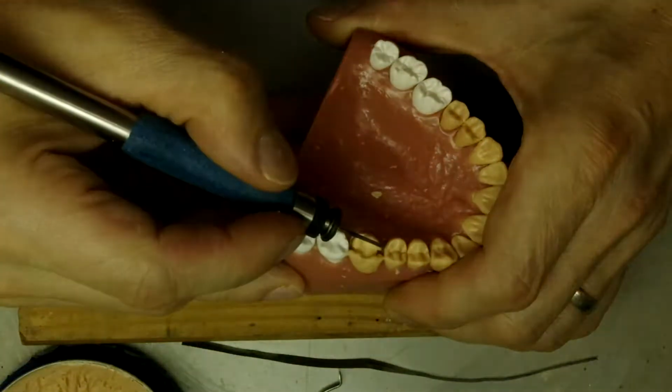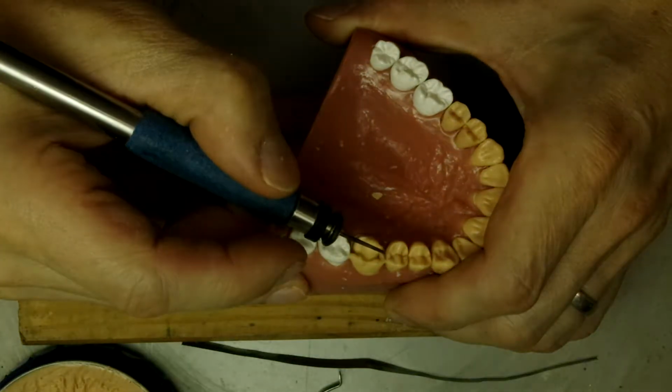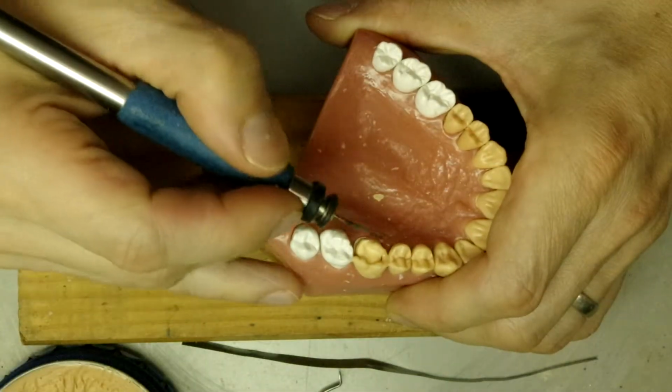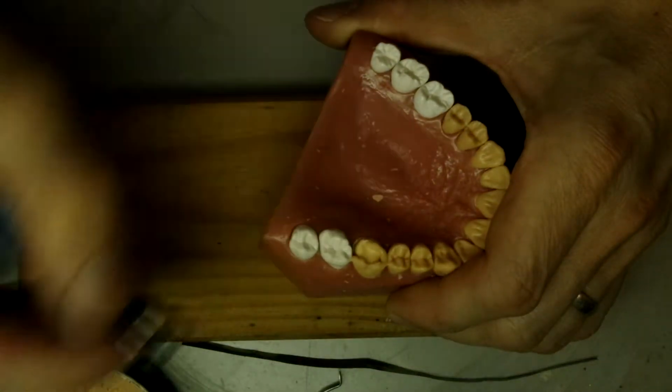So now we do the mesio-marginal ridge. Make sure that the marginal ridge goes right up against the adjacent tooth.